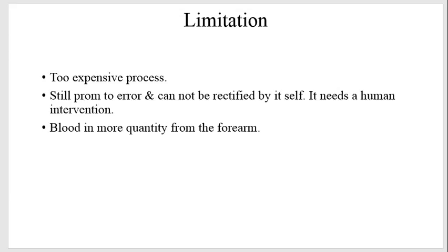The main advantage of the hemocytometer over the automated techniques is that it takes a very small amount of blood, which you can easily take from a fingerprick. It doesn't require any electricity or any mechanism other than an optical microscope, and since our algorithm is running on a computer, we can use a laptop as we talk about electricity requirements. It is also less time consuming, and here we can actually see what is inside the cells. Trusting a machine and seeing it by eye makes a lot of difference.